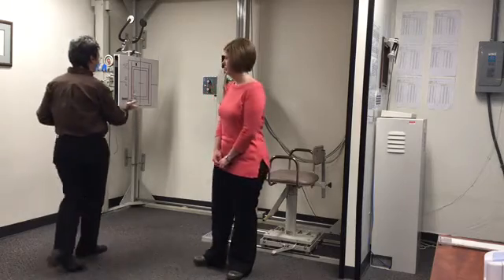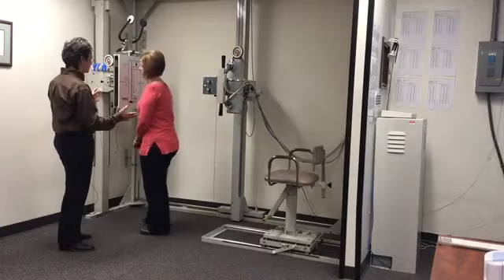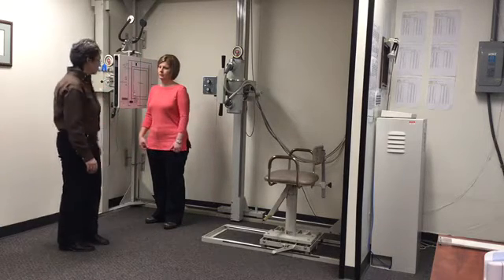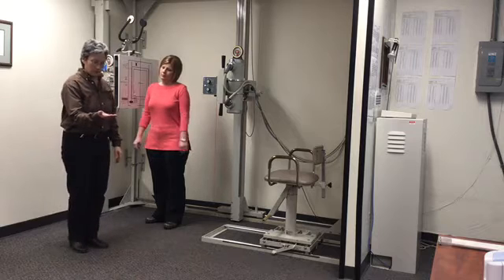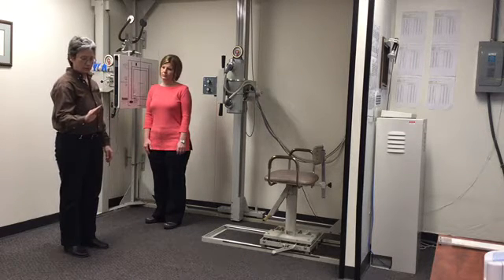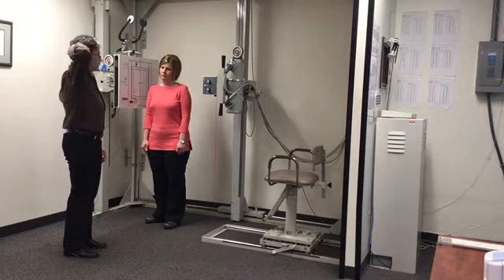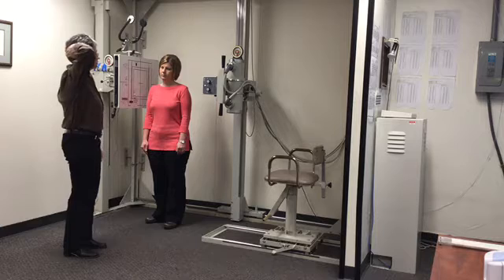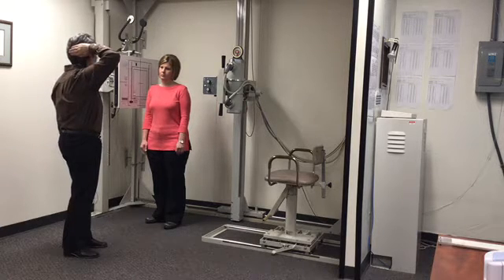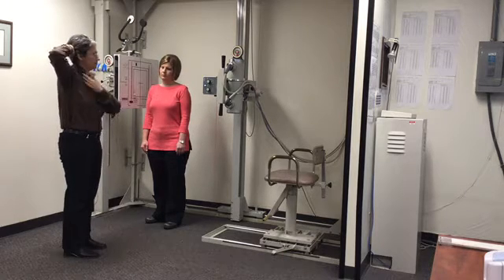And I'm going to have you step in to the point that we would be positioning the patient herself for this particular version of the image. So for a Yochum and Rowe version, you want to make sure that the patient's fingers and thumb are together, and you're going to ask them to place the palm of the hand up against the occiput. It's important that you don't get the fingers down into the cervical spine, okay? So you're going to keep the hand up, and this brings the elbow up and the shoulder back, okay?